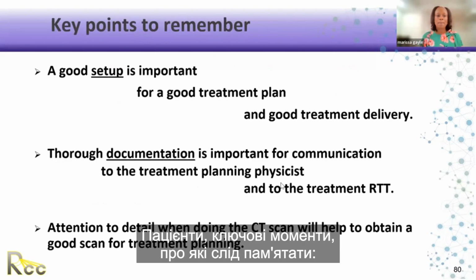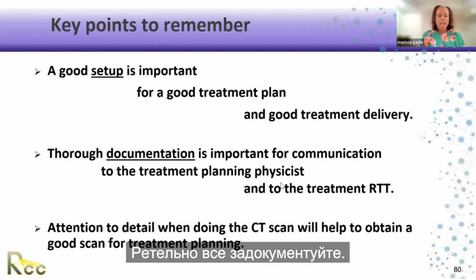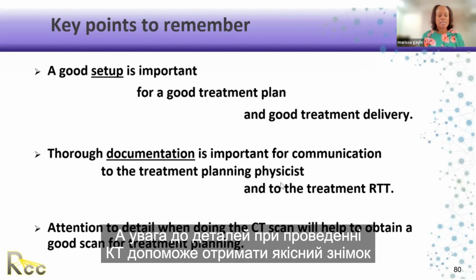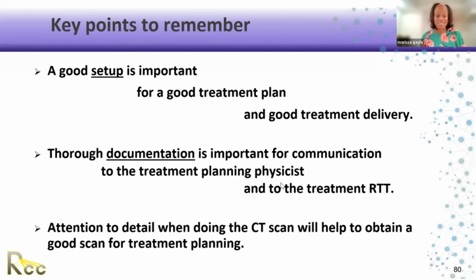Key points to remember: a good setup is important for a good treatment plan and for good treatment delivery. Thoroughly document everything. Communicate everything to the treatment planning and physics team. And attention to detail when doing a CT scan will help to obtain a good scan and treatment plan. That ends my talk. Do you have any other questions or concerns?